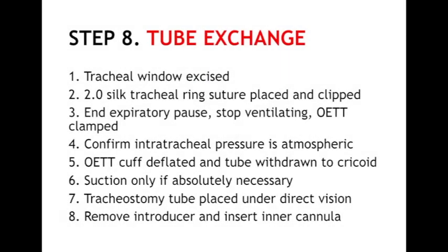With the cuff inflated and ventilation continuing, the 2-0 silk tracheal ring rescue suture is placed and clipped. Hemostasis is performed and suctioning if required. Extreme care must be taken with the secretions emanating from the lower respiratory tract.